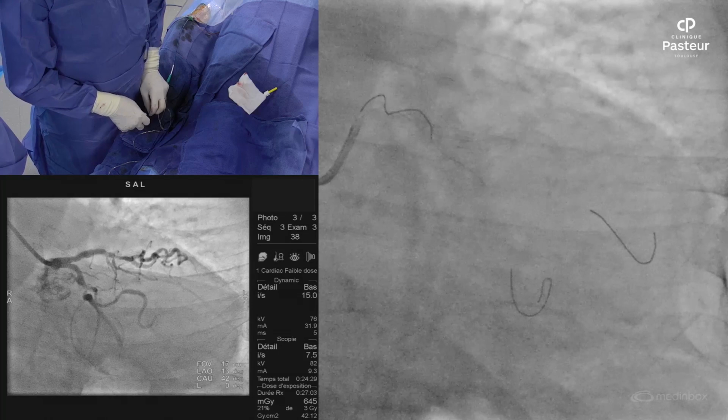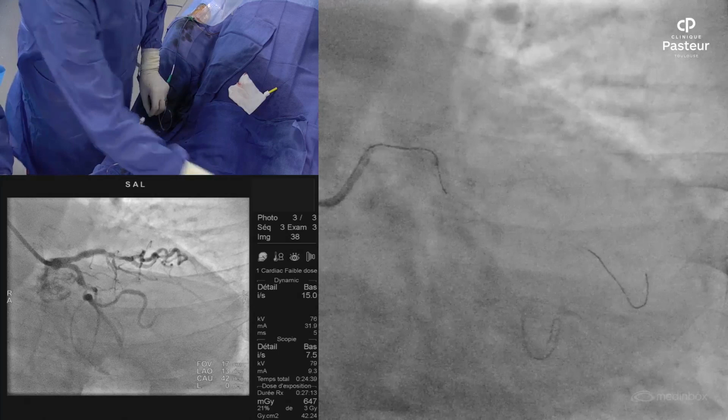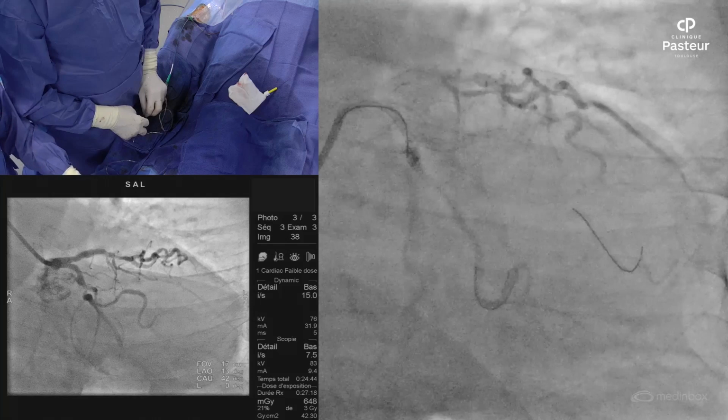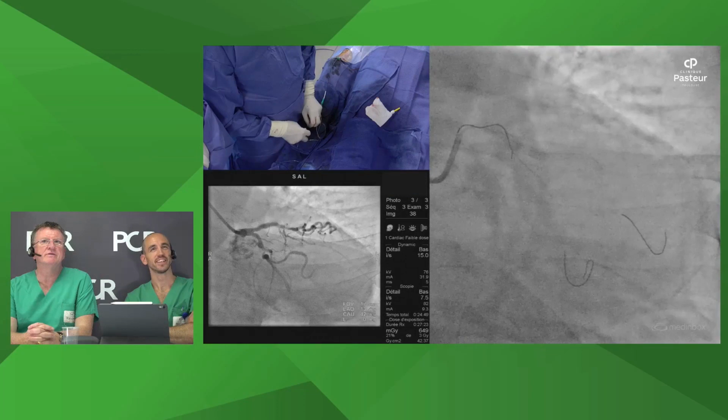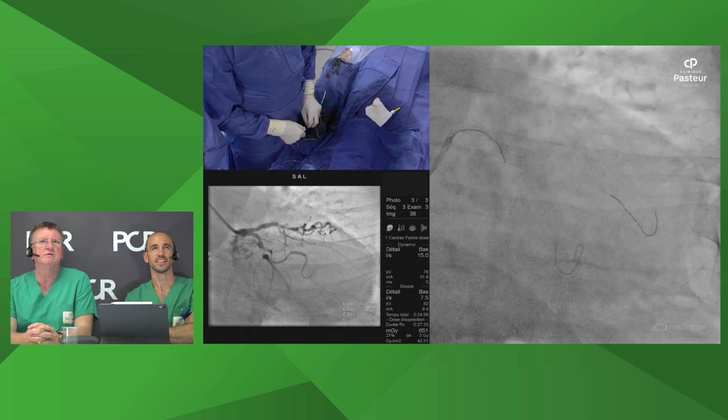Okay. Here maybe. Are you sure that you are in the stent? No. I do not feel this metallic feeling that you have when you go through the struts. I do not feel it. But really, honestly, I'm not sure. The advantage of using the OM1 wire is that you know that you'll be within the stent architecture when you cross, but then you lose your wire position distal in the OM1. That's correct, yeah.